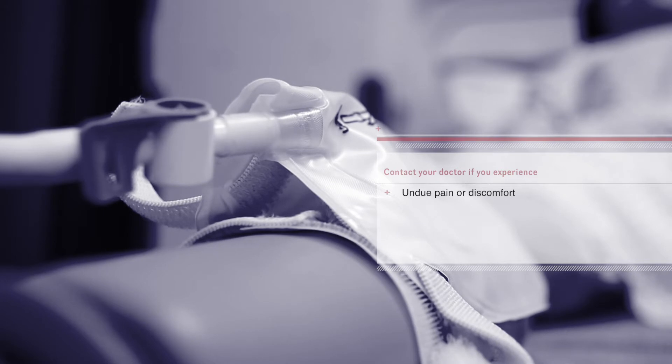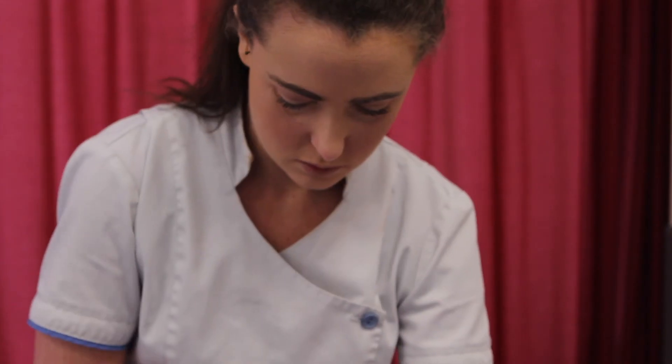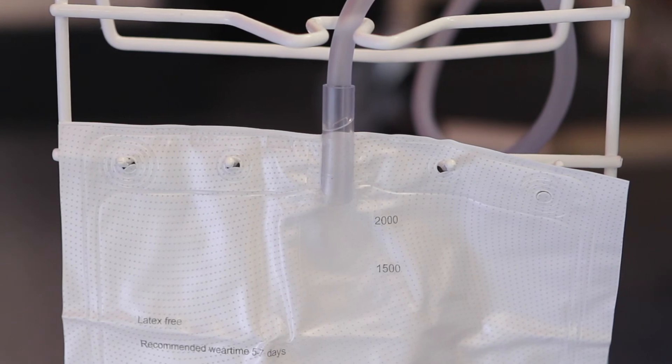Please contact your doctor if you are experiencing any undue pain or discomfort, if your catheter is not draining or is continuously bypassing, or if you notice blood or blood clots in the drainage bag. Ensure you have an appointment with your doctor to have your catheter changed at regular intervals. If you have any concerns regarding your urinary catheter, contact your local doctor or healthcare provider.